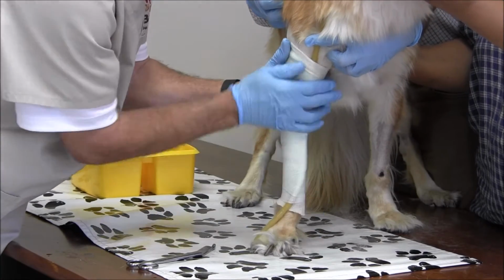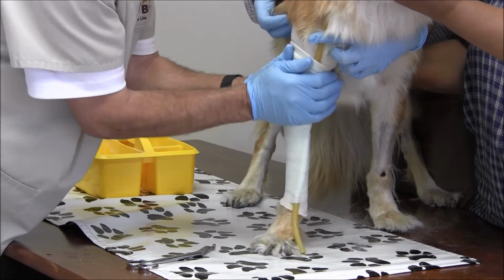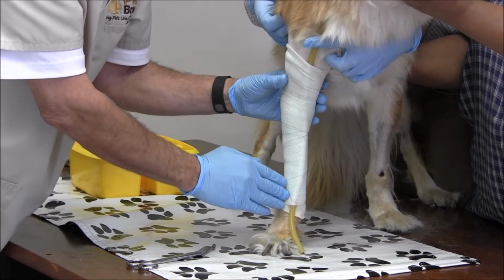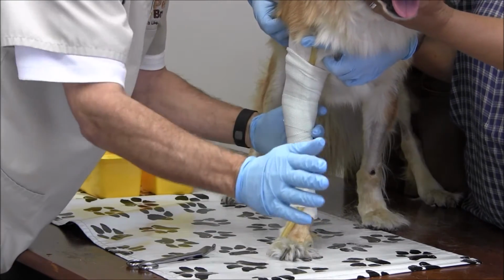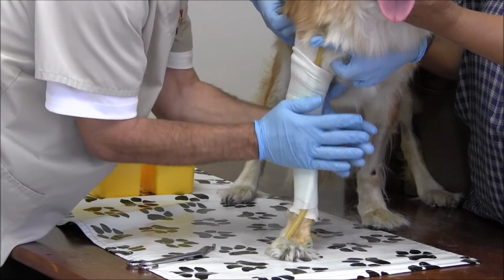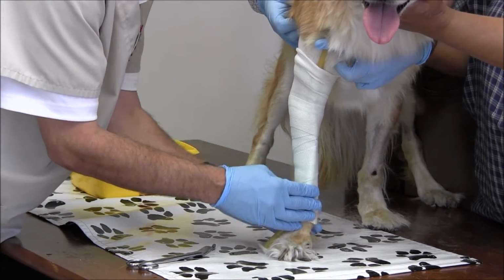Now we're going to massage in the fiberglass casting tape. And it's really important that when we cast for an elbow brace that we maintain the alignment that we want the brace to be in. And we also want to make sure that the paw is going forward and it's not externally rotated or internally rotated. We also want to make sure that we flatten out the forearm here. We want it this way, that will help in suspension. And we also want to make sure that we mark where the carpus is.